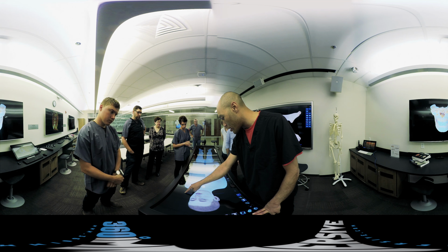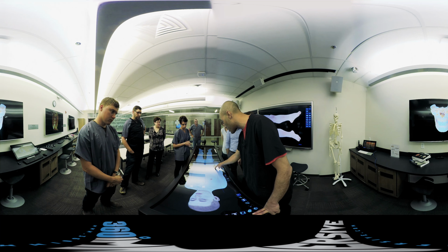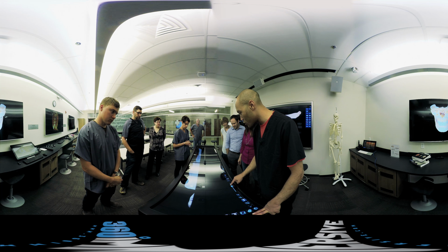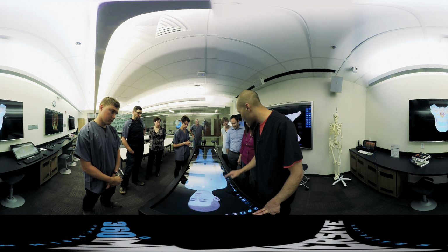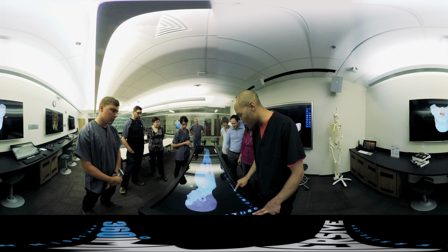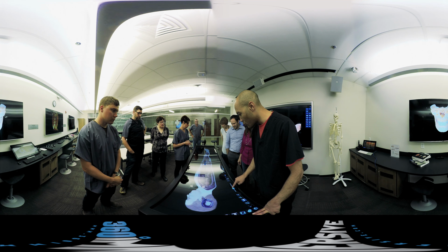We could do a transverse section. We could do a sagittal section. We can even turn this guy and get a frontal section as well. And we can, with this toggle switch, take a trip through the body. But the fun thing is if we turn it up, now we can really appreciate some of the deeper structures as we take a trip through. And we'll do a really quick tracking all the way through and kind of see the power.